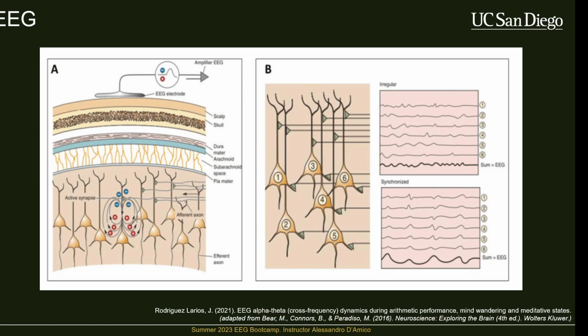What we're left with is something that resembles a much flatter signal, right? We had this oscillation that was oscillating at some frequency, not that fast, but still fast. And if you just average two given points throughout the sequence, you end up having something that's much flatter. So there are no oscillations in here. That's the low pass filter. So averaging is the simplest low pass filter. And it's sort of annoying, but the easiest way to explain high pass filtering is like the inverse of a low pass filter. But you don't really see a lot of natural high pass filters most of the time.